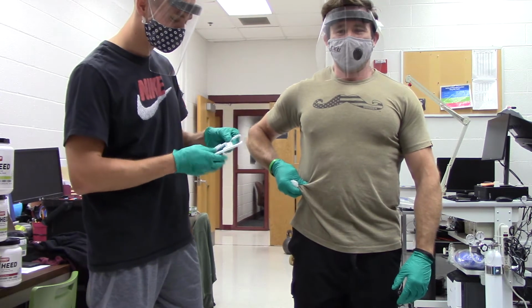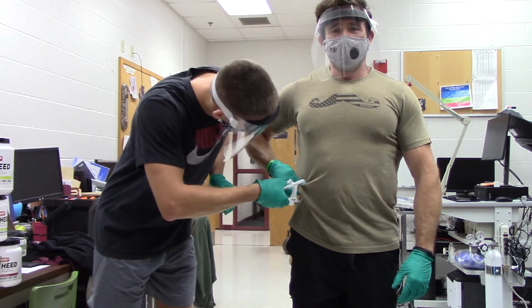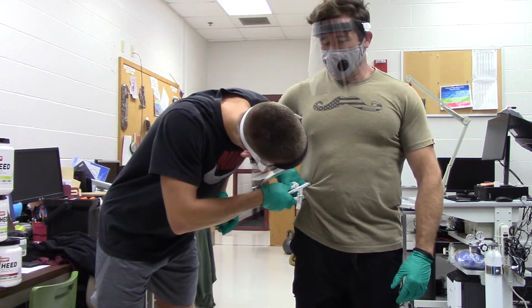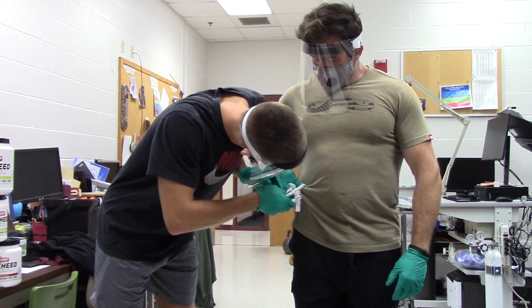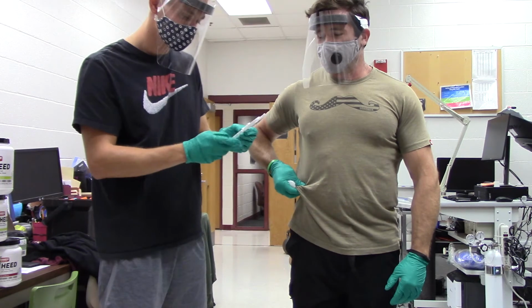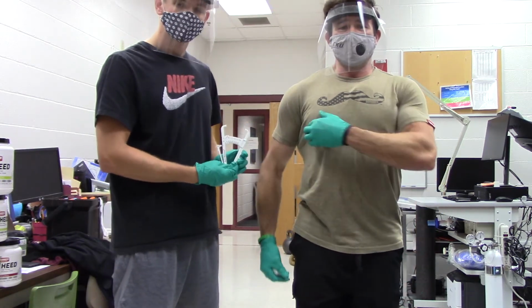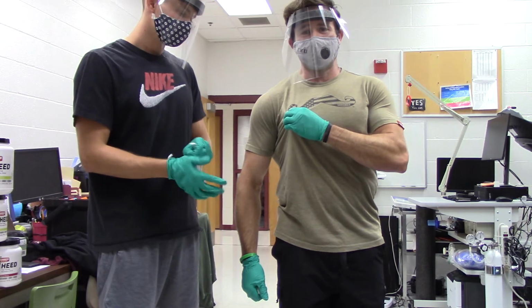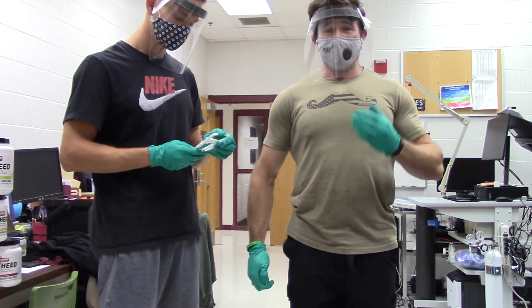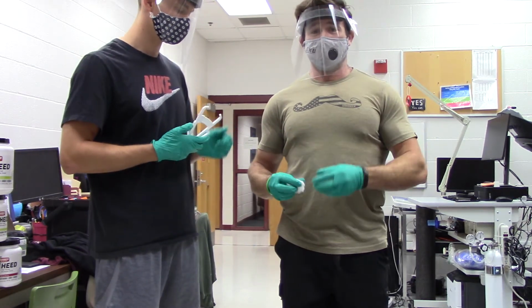There you go. So from here, I'm going to go ahead and hold that measurement. He's going to go ahead and pinch it in so he gets just the skin and the fat. Good. He's going to open it on up, and then we're going to take that measurement. Now, since this t-shirt is really thin, we're not going to have to subtract any extra, but if you're wearing a thicker t-shirt, we're going to go ahead and measure that out. We're going to show that more when we get to Ihor in the lower body.